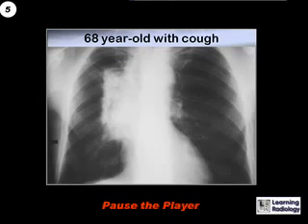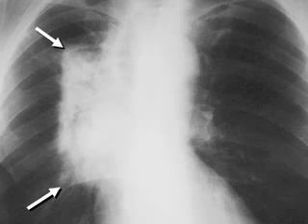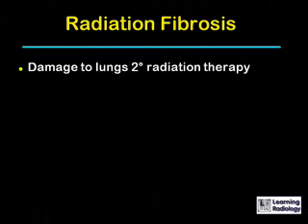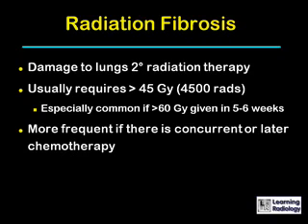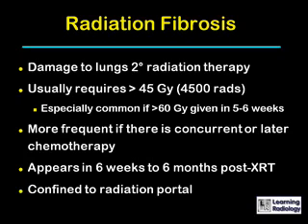The next case is a 68-year-old with a cough; you're looking at a chest x-ray. This soft tissue density in the right hilar region is unusual because of its relatively straight edges and 90-degree angles, which mark it as a manifestation of radiation fibrosis. Radiation fibrosis occurs when there is damage to the lung secondary to radiation therapy. It usually requires in excess of 45 gray (4,500 rads), and is especially common if more than 60 gray (6,000 rads) are given in a five- to six-week period. It is more frequent if there is concurrent chemotherapy administered after the radiation. It generally appears within six weeks to six months following radiation therapy, and it is confined to the radiation portal.